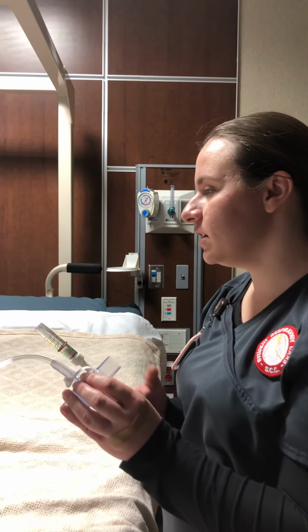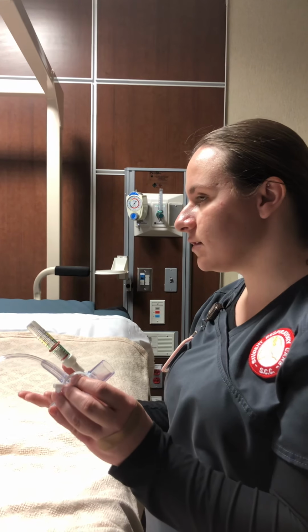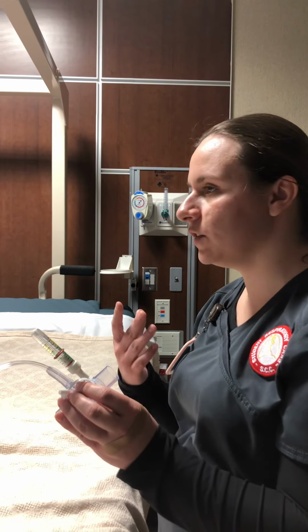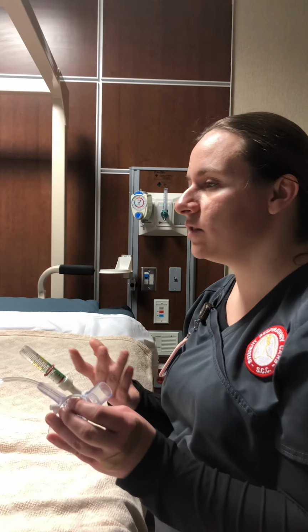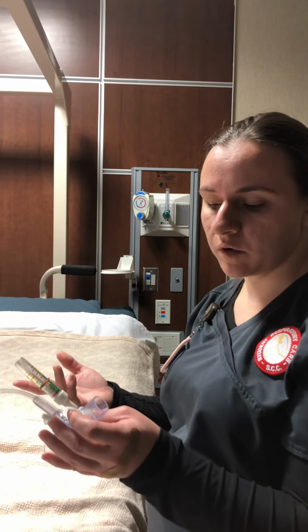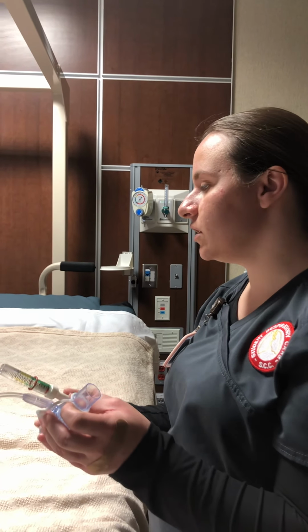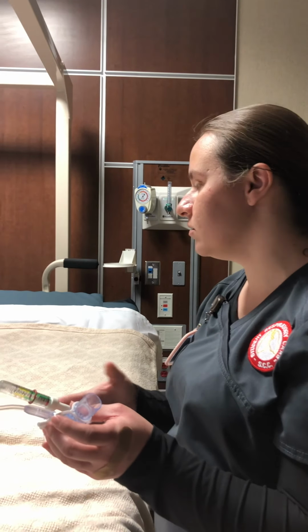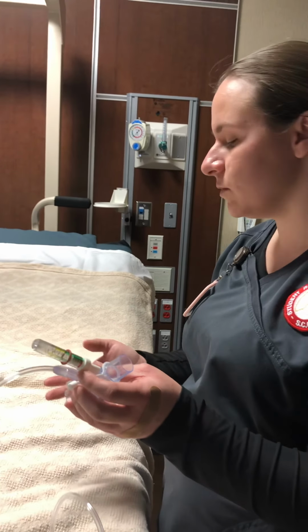And so what I'm going to have you do is take a nice deep breath in and then exhale. Have a nice strong exhale, but you only have to breathe in and out for like 3 to 4 seconds. So it's like a 1 to 3 or 1 to 4 ratio. So we'll do that a few times, and then I'll let you take a breath break and let you breathe normally. Make sure you're breathing okay, not feeling overwhelmed.